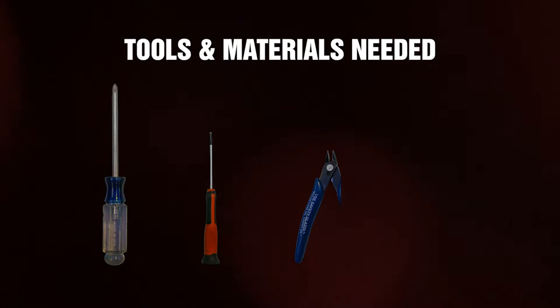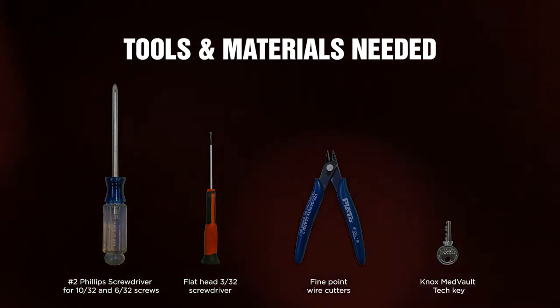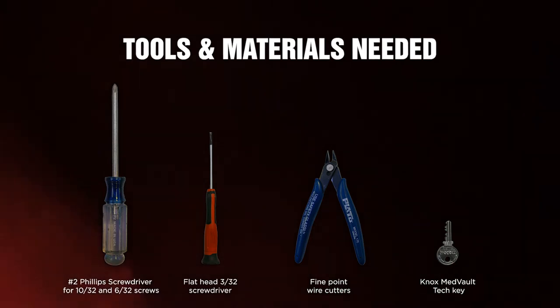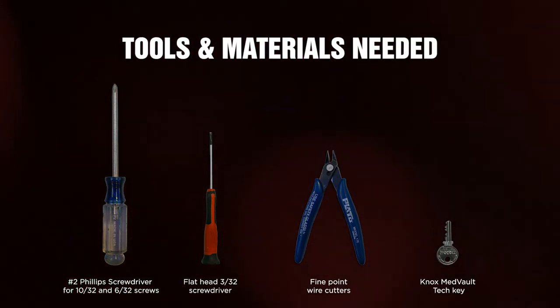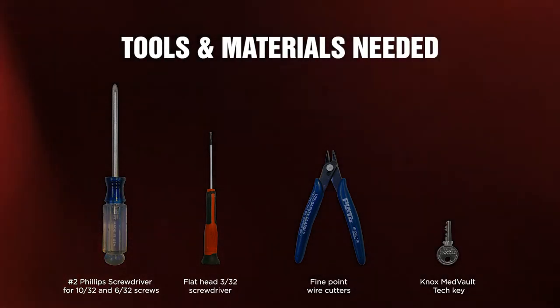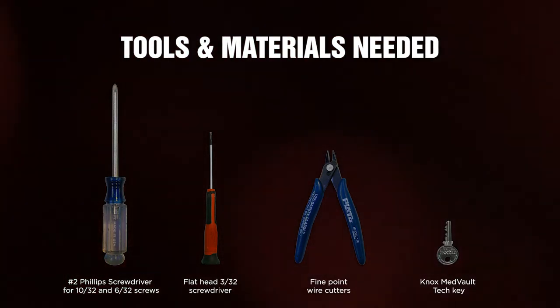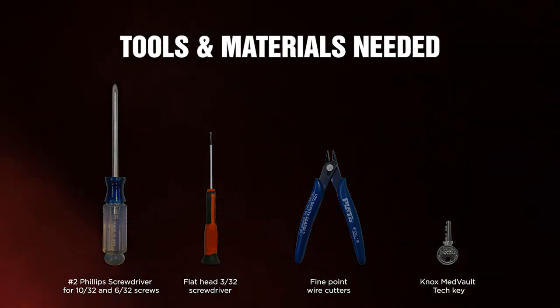The tools and materials needed for the installation include: a Number 2 Phillips screwdriver for 10-32 and 6-32 screws, a flat head 3/32 screwdriver, fine point wire cutters, a Knox Medvault Tech Key, and the Knox Medvault 2.5 retrofit kit, which contains a new circuit board and all additional materials needed to remove and replace the board.